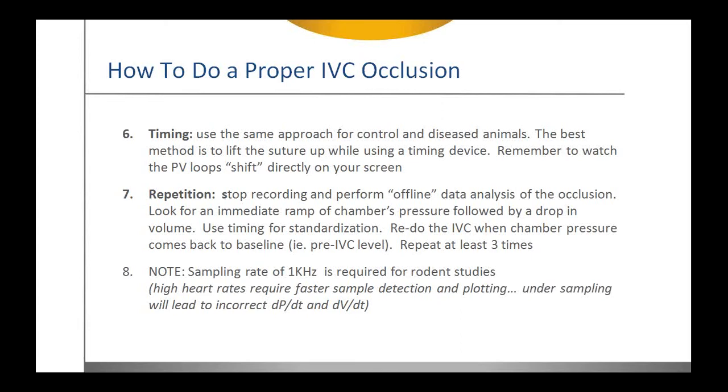Look for an immediate ramp of chamber pressure that should be followed by a drop in volume. Please use timing for standardization and redo IVC when chamber pressure comes back to the baseline. Don't redo it 1 second apart. Just wait until everything gets back.